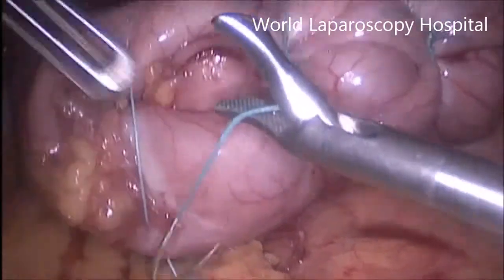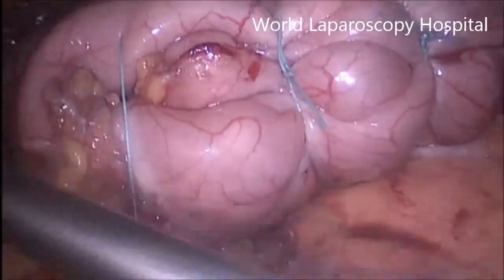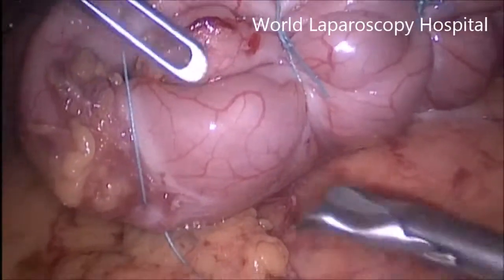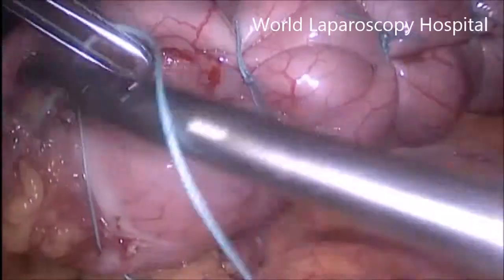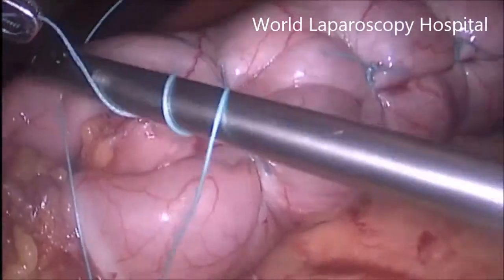This is the first layer. In the second row of the suturing, all the spaces which you are seeing bulging out also have to be covered. That is important.